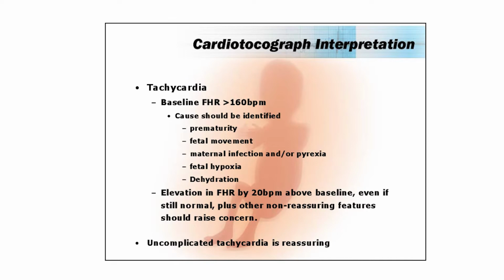We don't have good criteria to apply to the preterm infant because of the physiological shifts. You all know that there is a world of difference between a 24-weeker and a 26-weeker. Between a 30-week fetus and a 32-week fetus. Every week makes a significant difference to a fetus, particularly prior to 36, 37 weeks, doesn't it? So we probably will never have gestational specific interpretation criteria because they're so dynamic as the fetus moves.